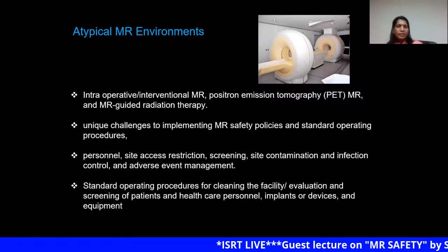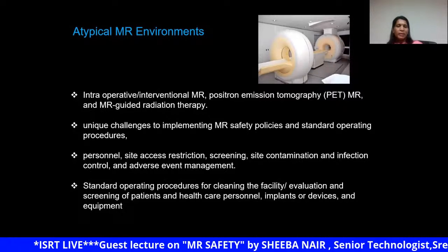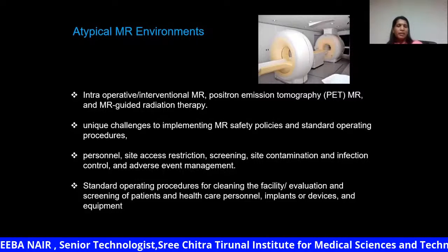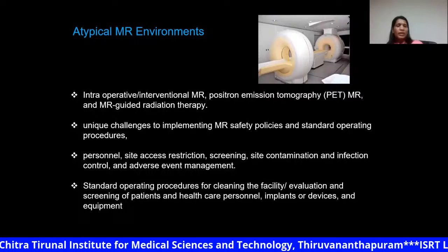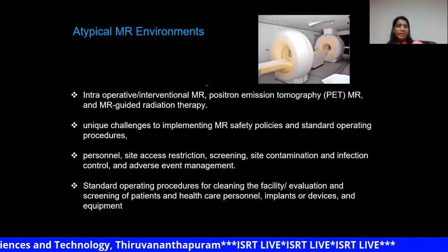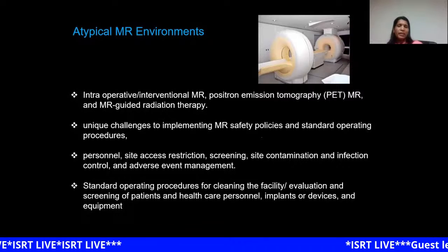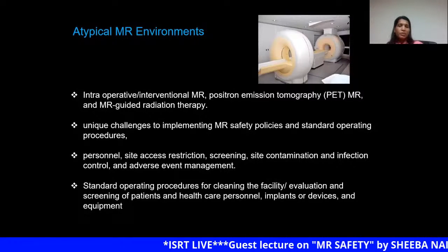entries into zone 4, and there will be a lot of staff: nurses, surgeons, and nuclear medicine people. So the staff entering along with the patient will be different. These modalities should have separate standard operating procedures for screening and performing safe examinations.